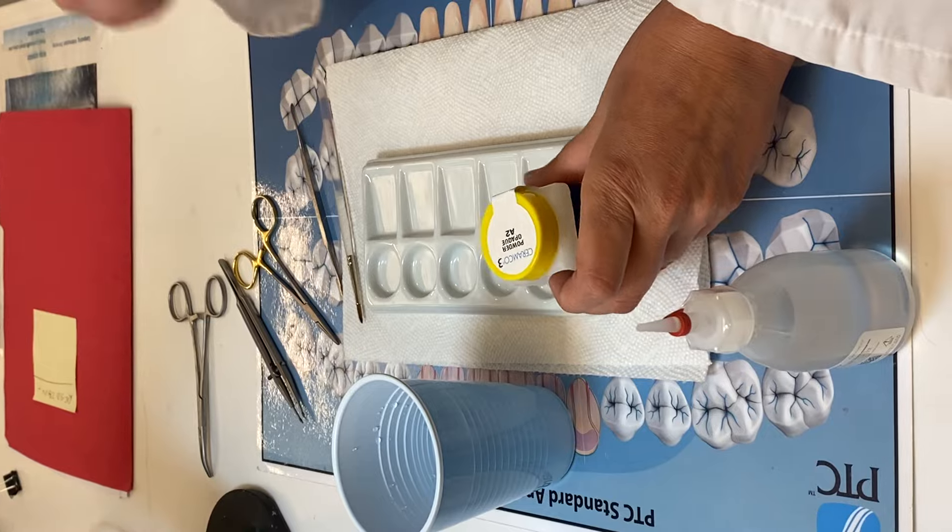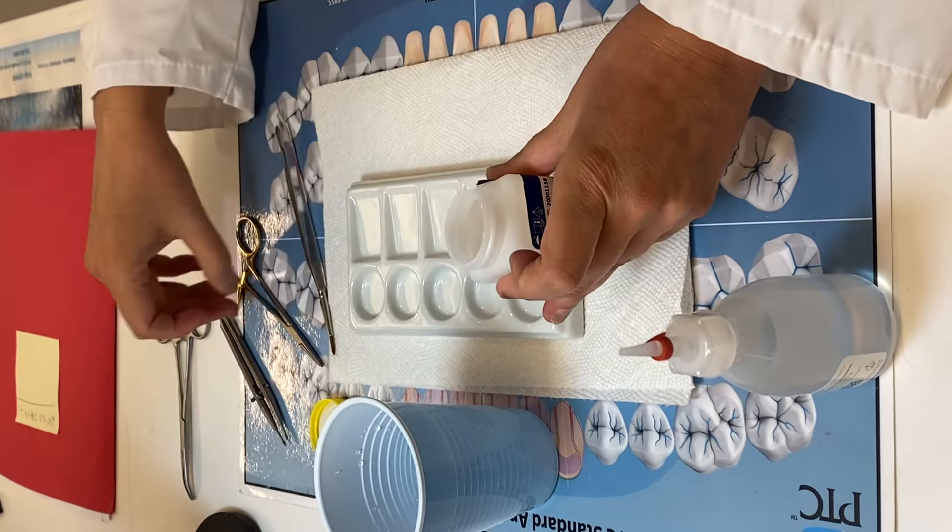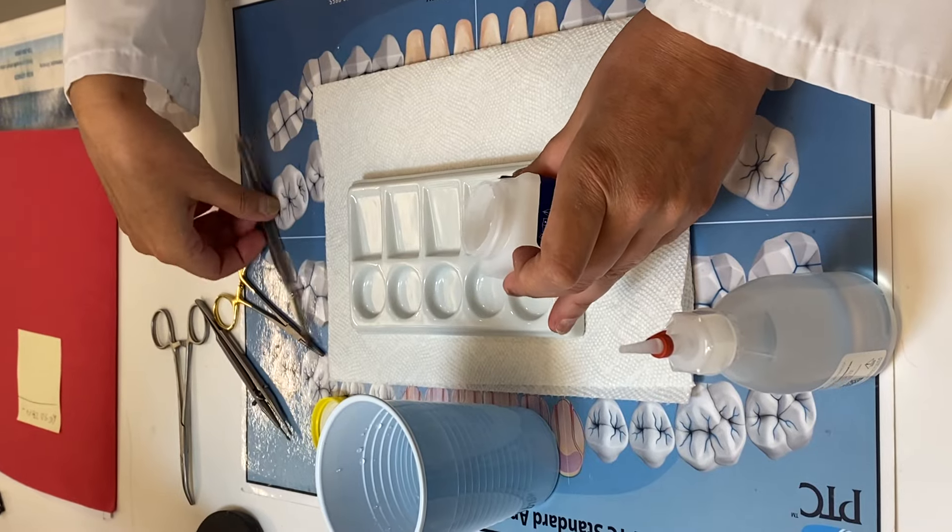And then we're going to start with the powder. So we have the opaque powder, and we're going to take a little bit of the opaque.